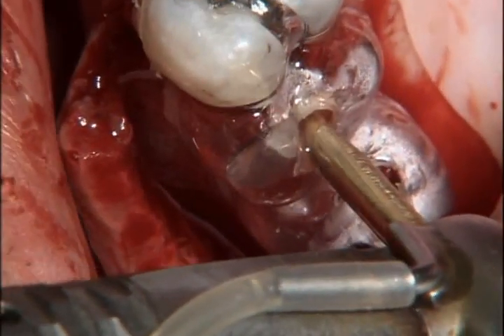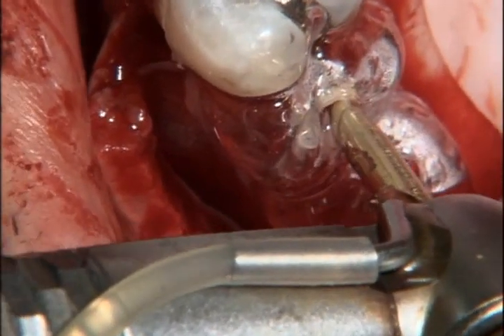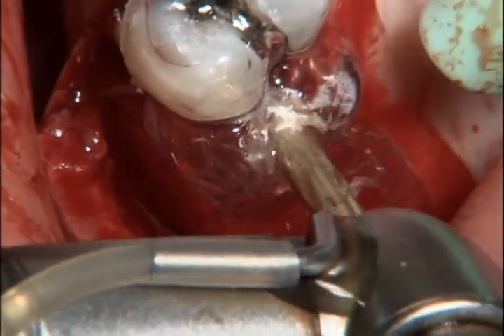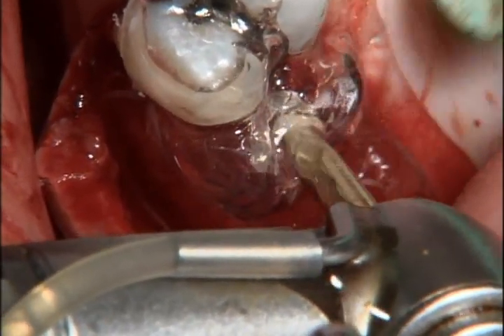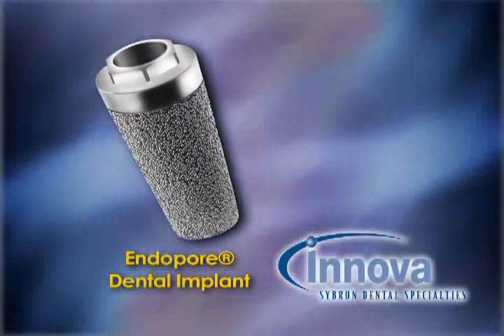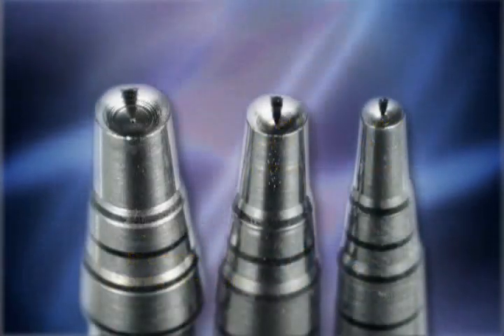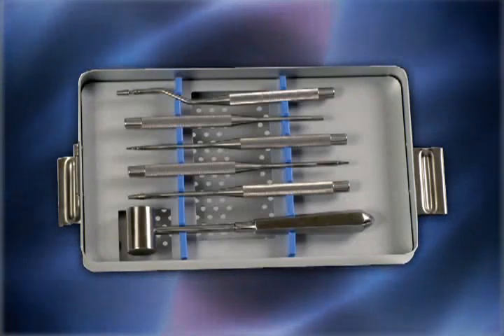A surgical guide was then employed to mark the implant sites, keeping in mind that there must be a horizontal distance of 3 millimeters between the distal of the first premolar tooth and the mesial aspect of the second premolar implant, and a similar distance of 3 millimeters between the 2 implants. Because the Endopore implant is a press-fit design, it's ideal for placement with hand osteotomes in bone of low density. There are 3 osteotome tips of increasing diameter provided in the Endopore surgical instrument kit.